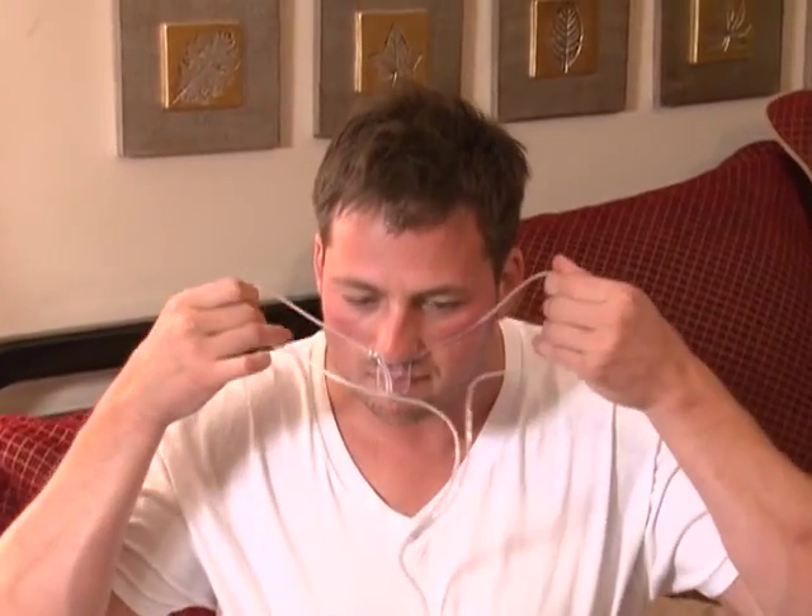Remove the nasal cannula from the pouch. Take the nose end of the tubing and position the nasal prongs into each nostril. Then wrap the tubes back and over each ear and adjust the slider beneath your chin. Once snug, apply tape on your upper cheek area or wherever comfortable to secure the tubing on your face as needed.